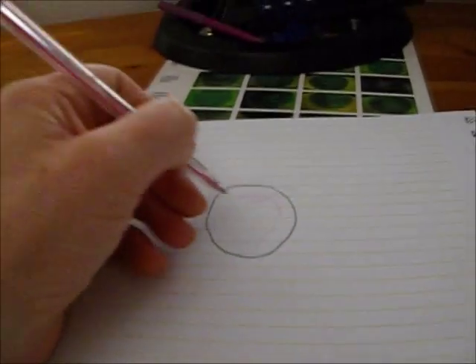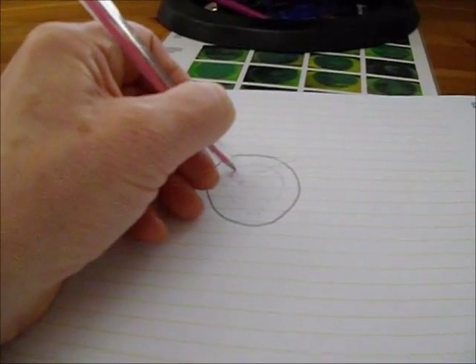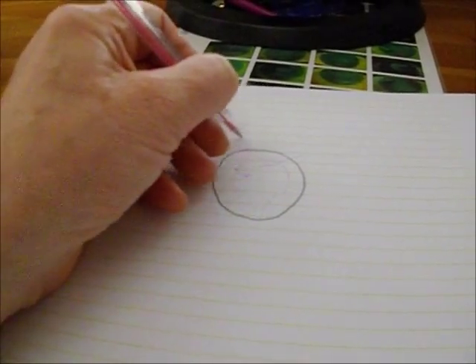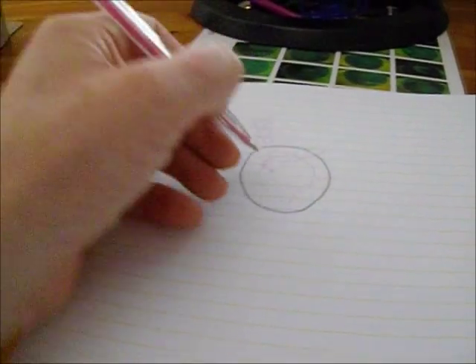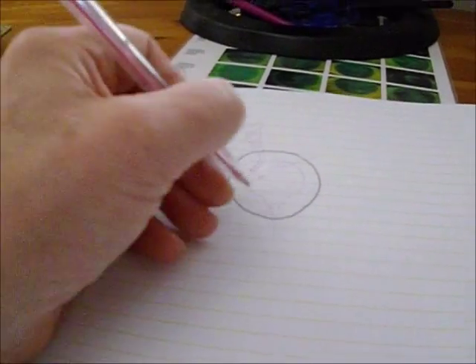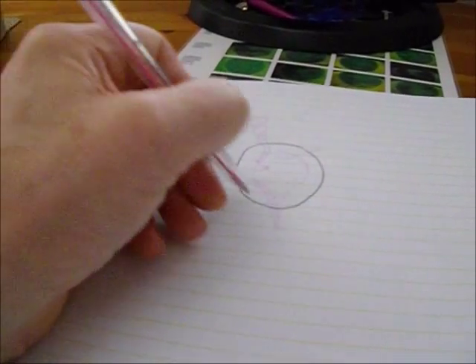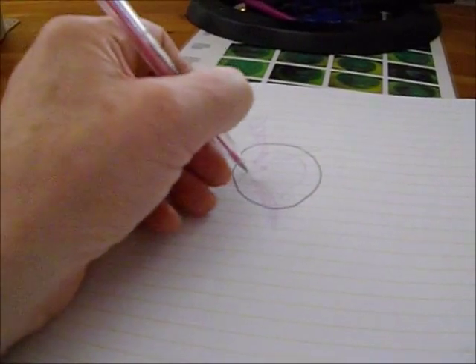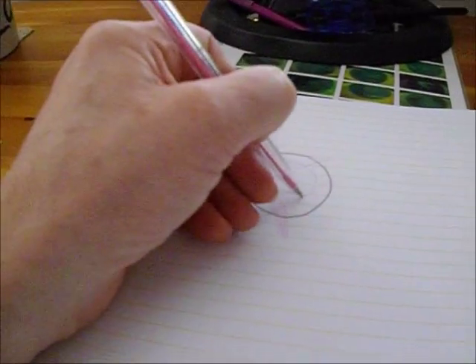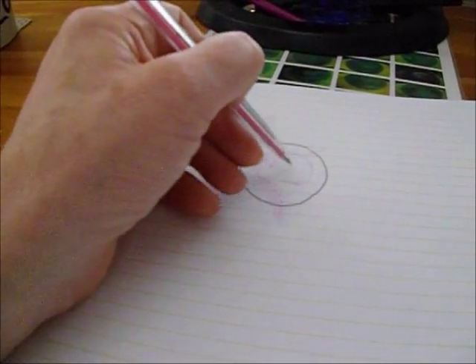Now look for the origin of the central retinal vessels and, using percentages, draw them on your drawing in red and draw the way they travel. Carefully draw any little vessels that kink, move, or change diameter. Now follow the edge and place any peripapillary atrophy into the drawing and label it. Then look at the surface of the neural layer as it dips and rises, and draw in any areas where it has dropped down, leaving vessels exposed or causing notching.